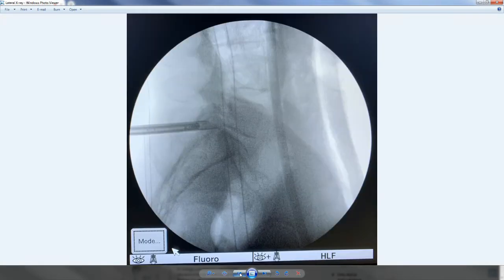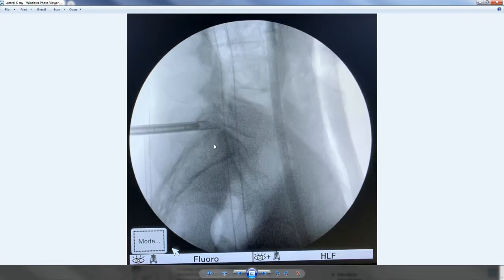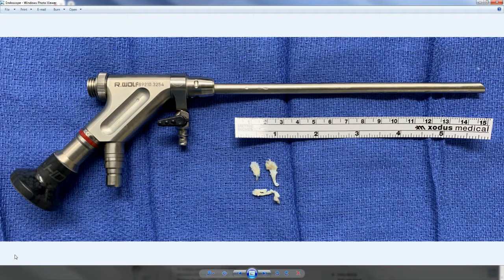This case is an L5-S1 interlaminar endoscopic approach. I've made a small incision about big enough to accommodate something the size of a number two pencil, and I dock my central cannula on the interlaminar window — the space between L5 and S1. I get a lateral x-ray after the endoscope is completely docked on the L5-S1 disc to make sure we're operating on the correct level. These are the intraoperative findings.